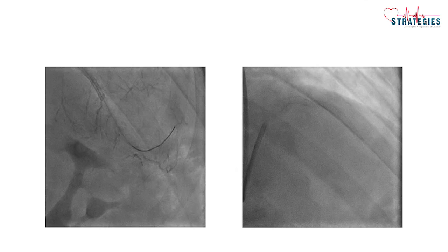In fact, we failed in this case 5 years before, as there is a change in wires and better microcatheters now. In fact, Caravel really helped in crossing these loops and completing these procedures. Probably Cyan wire and Caravel changed my intervention this time. Thank you.